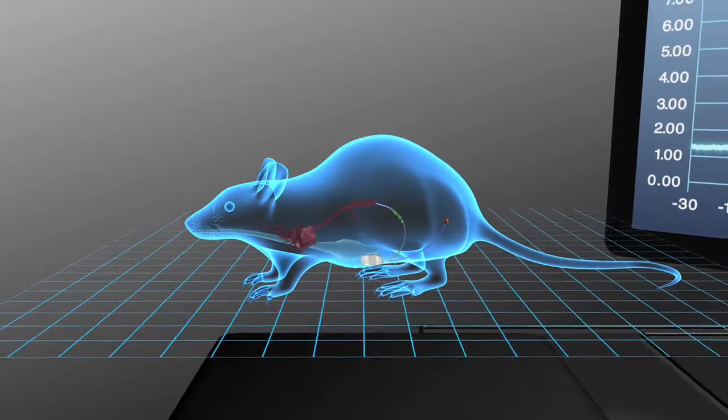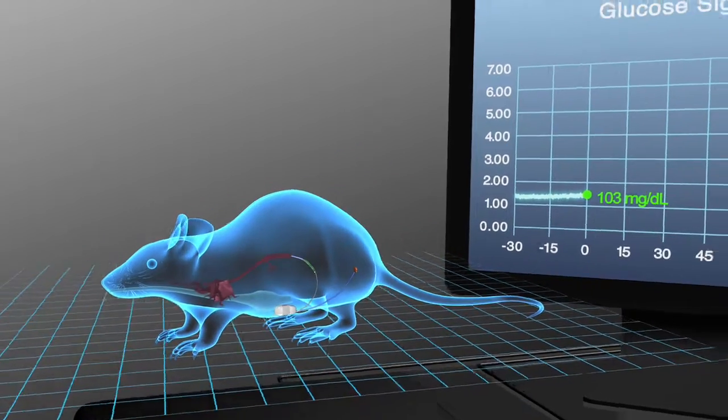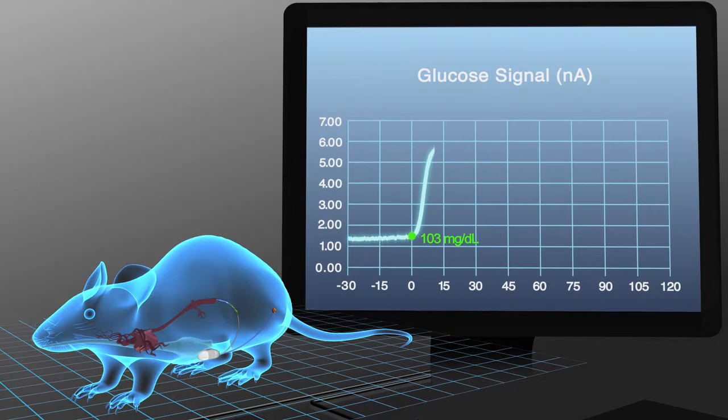Increase the animal's blood glucose level with an oral glucose administration. Observe the telemetry glucose data. The glucose level will peak approximately 12 to 16 minutes post-dose. Wait an additional 5 minutes after the glucose peaks and then draw duplicate blood samples once again.